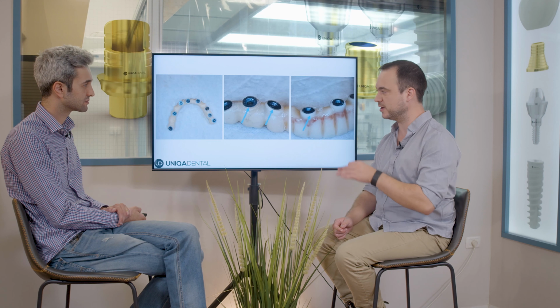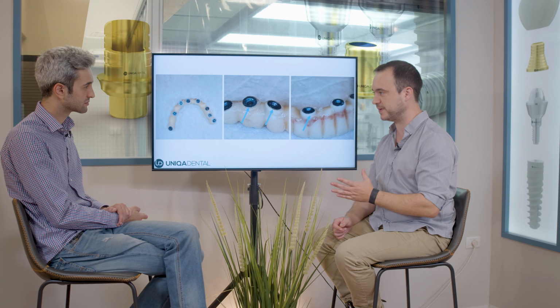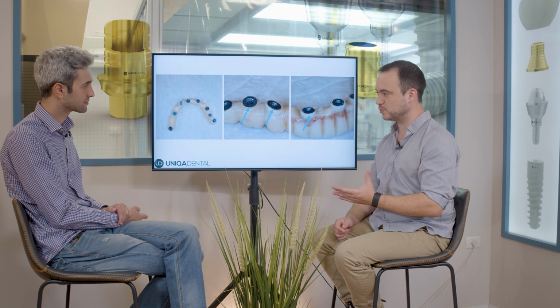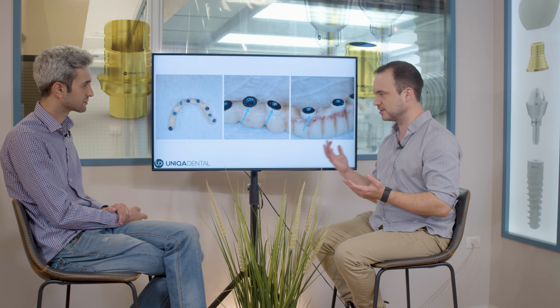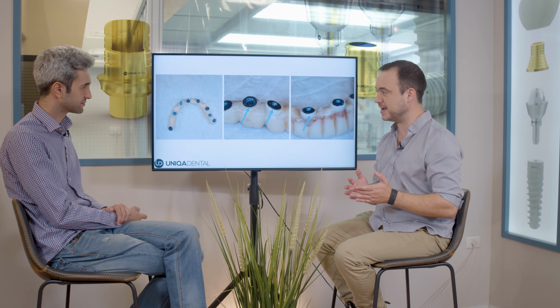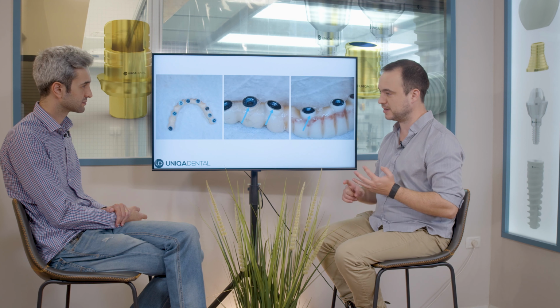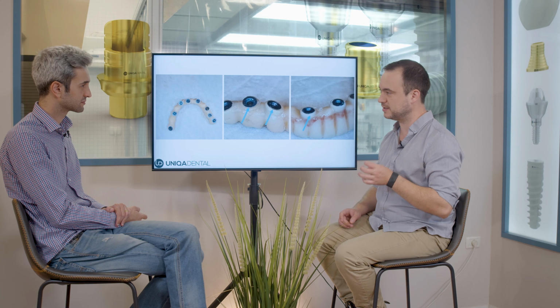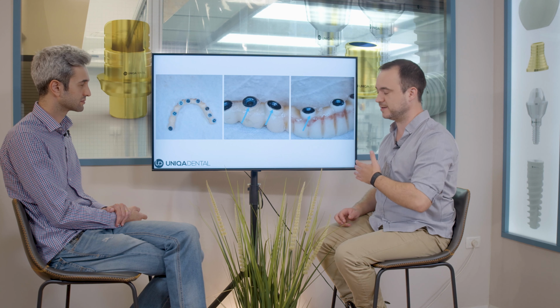And you can see that in some places, the fitting of the sleeve into the cavity for the sleeve is not perfect. But we did have a perfect occlusion. So why did it happen? The deviation. Yeah, this deviation: when we took the impression, the technician placed the scan markers on the impression that we took.